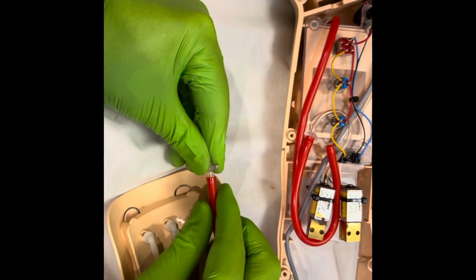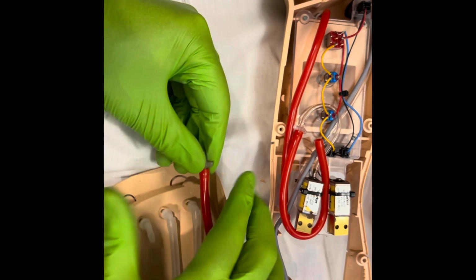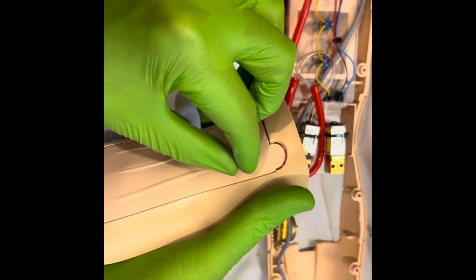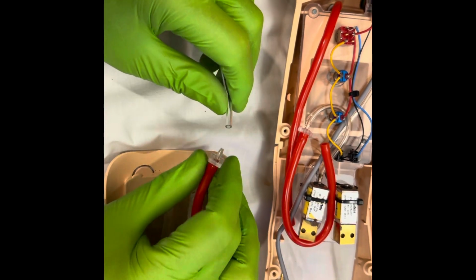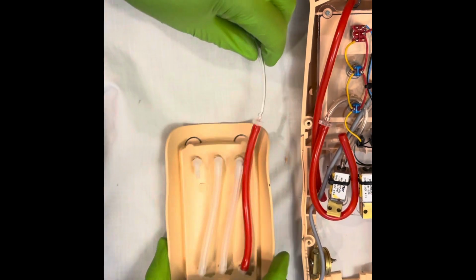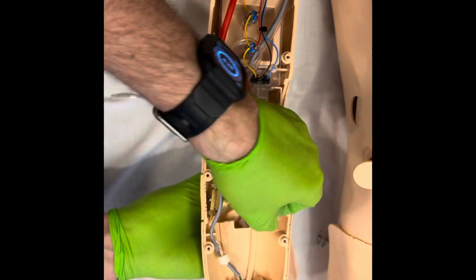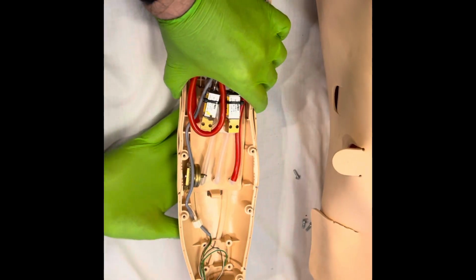The larger part will go to the red hose, or yours might be clear depending on what version IV pad you might have, because a couple versions have an extra little part on there to hold the pad down a little better. If you can't get this on, I'd recommend using a hair dryer to heat up this area. It makes it a lot easier to get onto the fitting here. So, all right, once we've got that on, just make sure the hoses are all in the correct spot. Let's send the longest one through. We'll just connect it on there for right now.